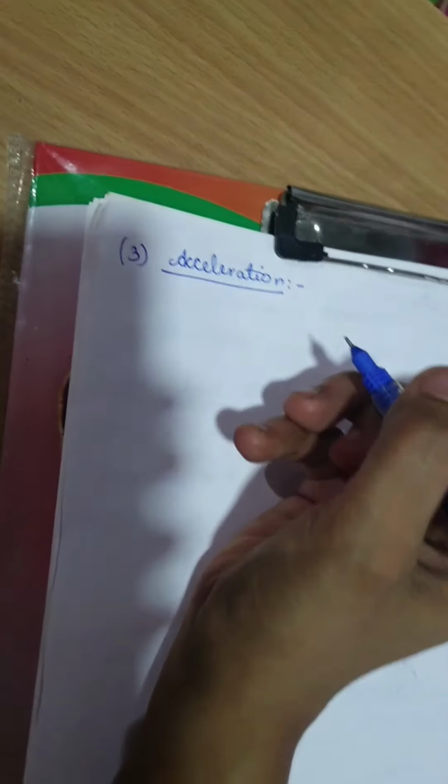Now the third point we will look at is the accelerations. Sometimes we see an abrupt increase in the baseline.